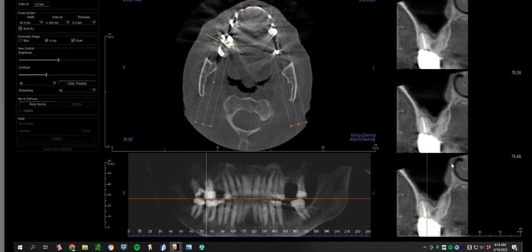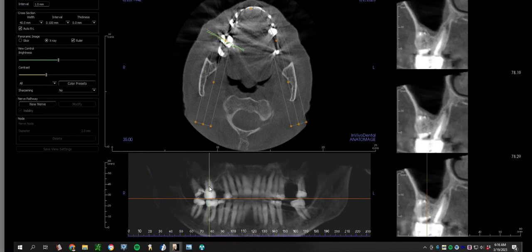So working with our ENT colleagues to get a better sense of what constitutes a referral is an important part of this conversation. But it's important to note that a lot of times these periapical radiolucencies associated with many teeth, specifically previously endodontically treated teeth, would be very hard to see or notice on a two-dimensional periapical film. You have all this dense cortical bone, which provides very little contrast to a radiolucency when looking at a two-dimensional image that's orthogonal to this view. Point being, we see things on CAT scans that we don't see otherwise.